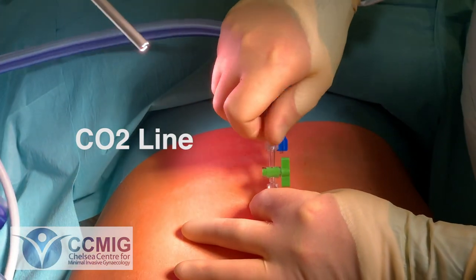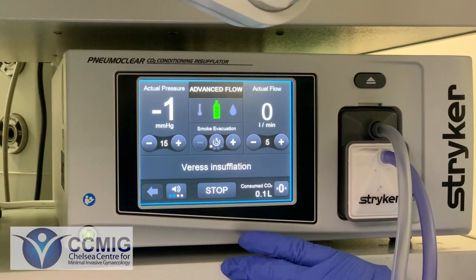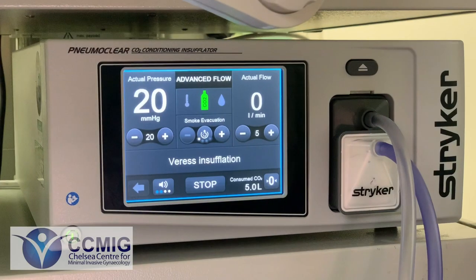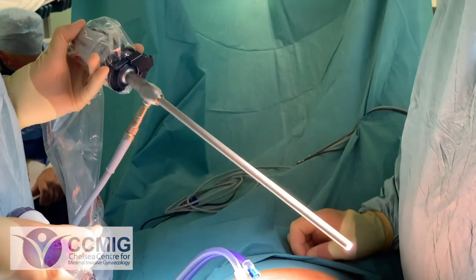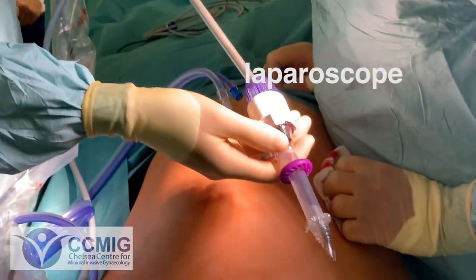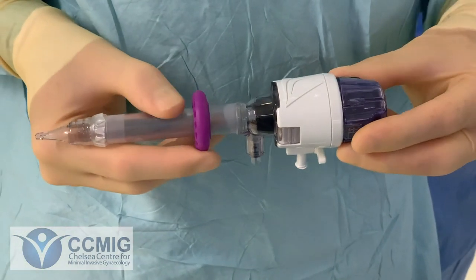Now we attach the gas. We use carbon dioxide because it's inert, and we use this insufflator or pump to fill up the abdomen until it's up to a certain pressure. You can see there where the skin reacts to the abdomen being filled with gas and the pressures now look good. It's time to go in with our laparoscope — a long camera with a light at the end, about 30 centimetres long — and we place it through this port you can see here. Taking a closer look at the port, you can see it has various features, including the pipe we used to fill up with gas.